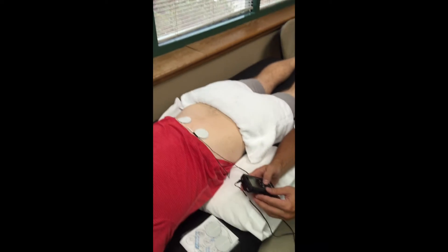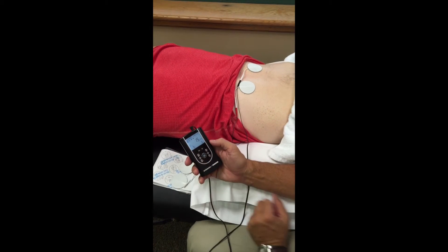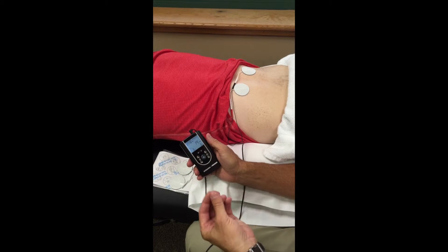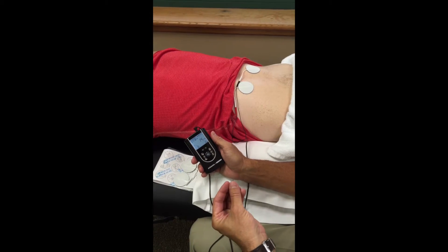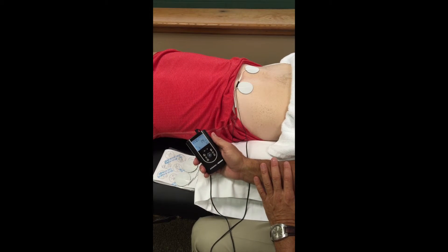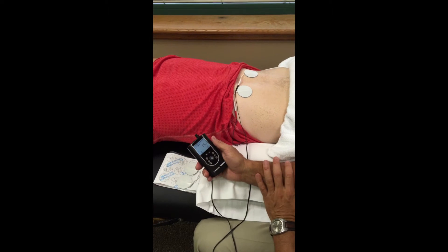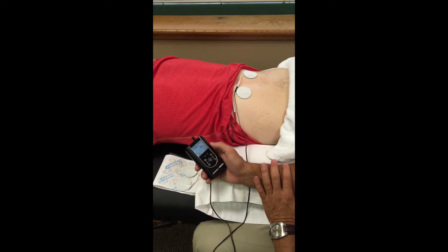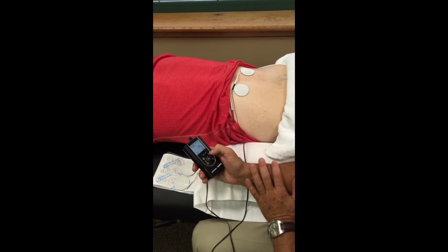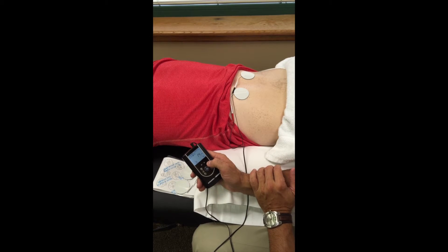From this point we will turn our machine on. We should already go through and set up where we want our parameters based off whether this is an acute situation, a subacute situation, or a chronic pain situation. Those parameters will be covered in much more detail in lecture and in lab. In this situation we've already got things set up and I'm going to go with a modulated frequency, so we're going to slowly begin to turn up very slowly.